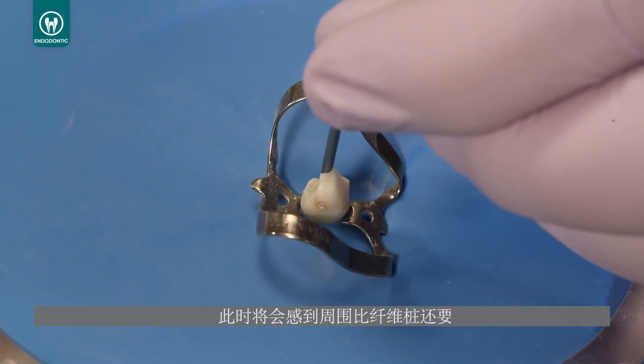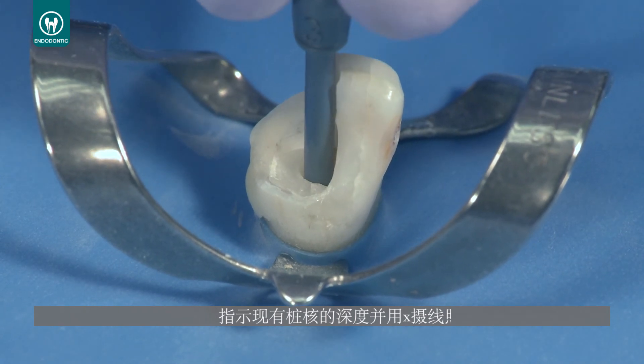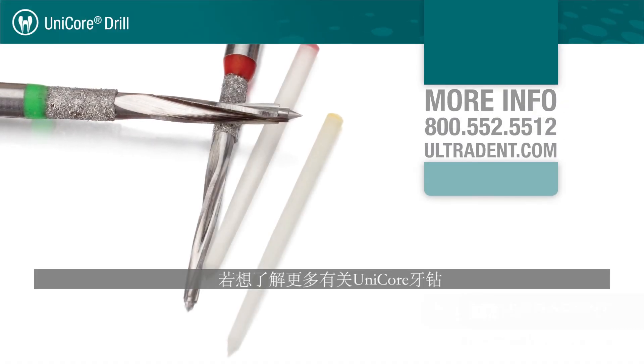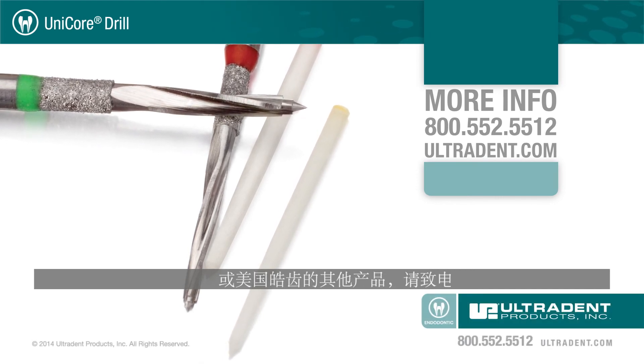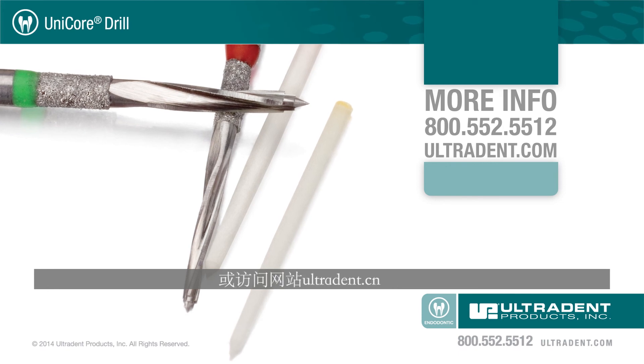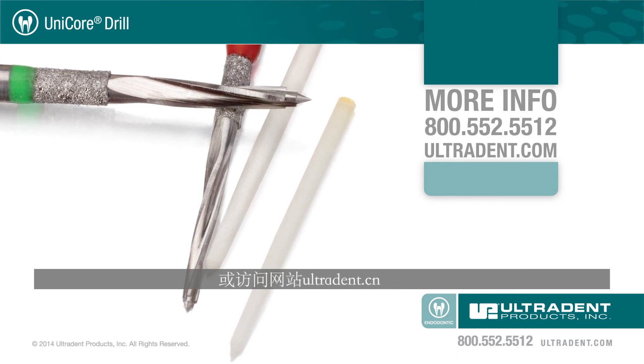Use a rubber stop to indicate the length of the existing post and confirm with a radiograph. For more information on the Unicore drill or any of Ultradent's other products, call 800-552-5512 or visit ultradent.com.